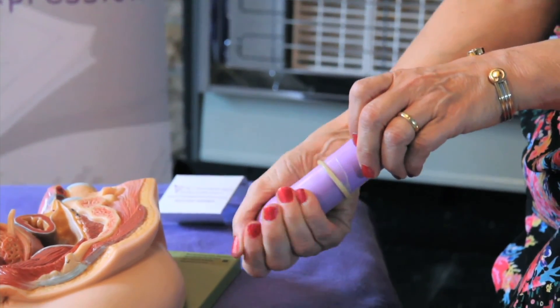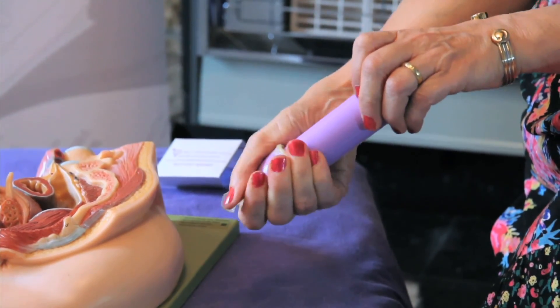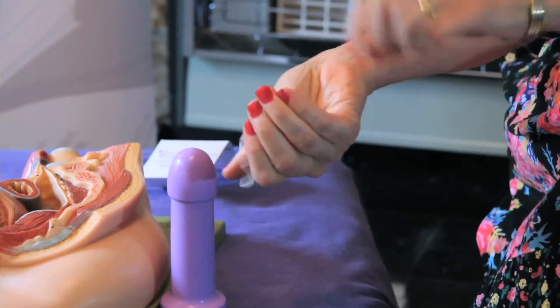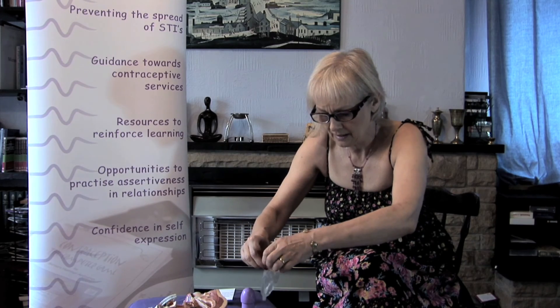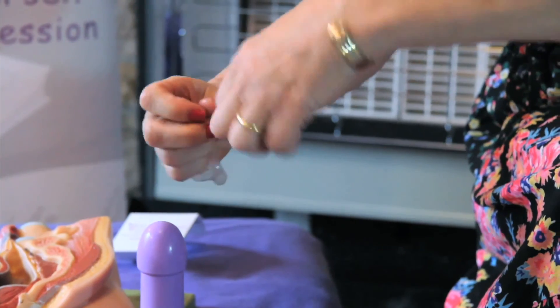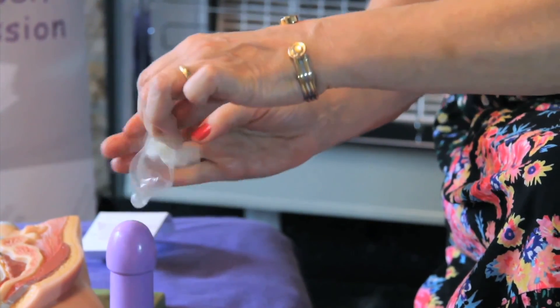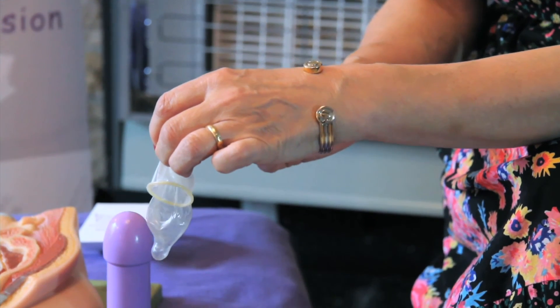Hold the condom at the base and take it off so that all the sperm stay in the bottom of the condom. Then tie it into a knot, wrap it in a tissue or a paper bag, and dispose of it in the bin. Condoms should never be flushed down the toilet because they can cause blockages.